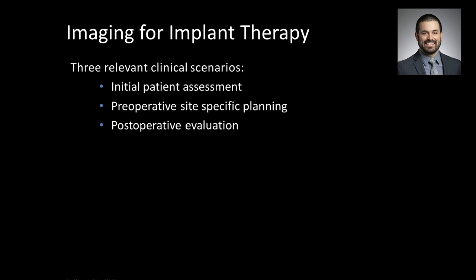Okay, in the last few minutes here, I'm really going to review the recommended or best practice for imaging around implants. And I'm going to break these into three distinct clinical scenarios.